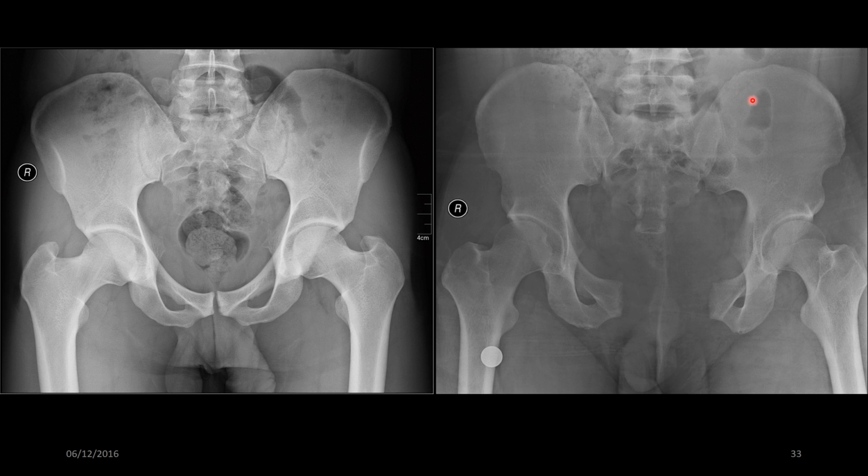And what you have here is disruption of your sacroiliac joints, and severe disruption of the symphysis pubis here. That means that this person has had a crush injury, and it's literally split the pelvis in two. If you were a doctor assessing this, you would feel the left and right hemipelvis, and it wouldn't be stable, and usually that indicates bleeding into the pelvic cavity.